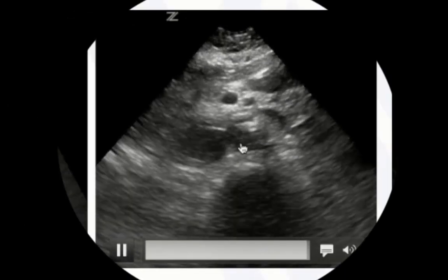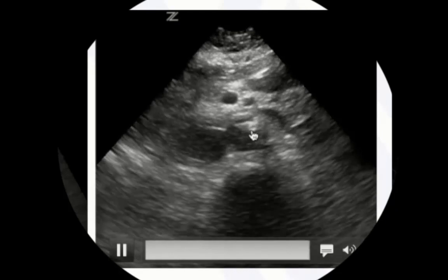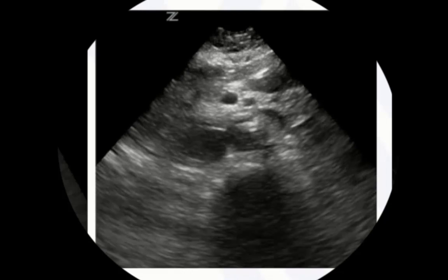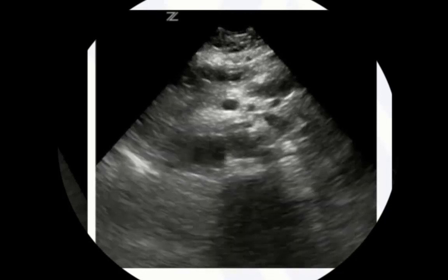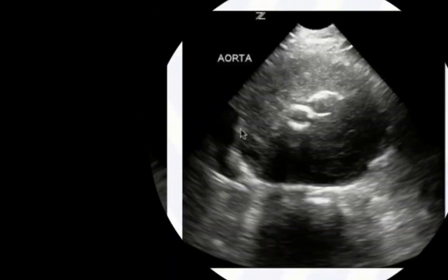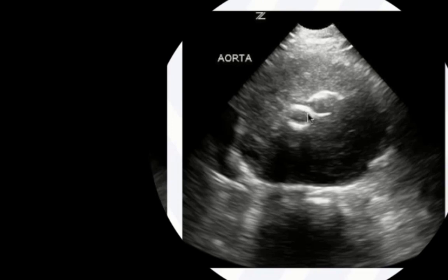Here we see an aorta with a flap that's moving during the cardiac cycle — this is an aortic dissection. Point-of-care ultrasound has high specificity but not high sensitivity for aortic dissection, so you can't rule it out, but you may rule it in. We may also have post-operative patients who have had an aortic aneurysm repaired and now have an aortoiliac graft in place — recognize those findings and don't let them confuse you. Interpret everything in clinical context.